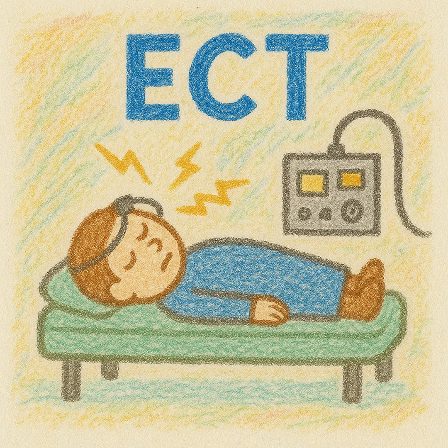You could do left unilateral. The reason why we do right unilateral conventionally is because Broca's area and Wernicke's area, the language centers of the brain, are typically lateralized to the left in most people, even left-handed individuals. And so by stimulating just the right hemisphere, it minimizes hitting important structures of the brain. But if somebody has some sort of right-sided lesion, or you somehow know that their language center is right lateralized, then you could certainly do it on the left. That's the only reason why we do it on the right.